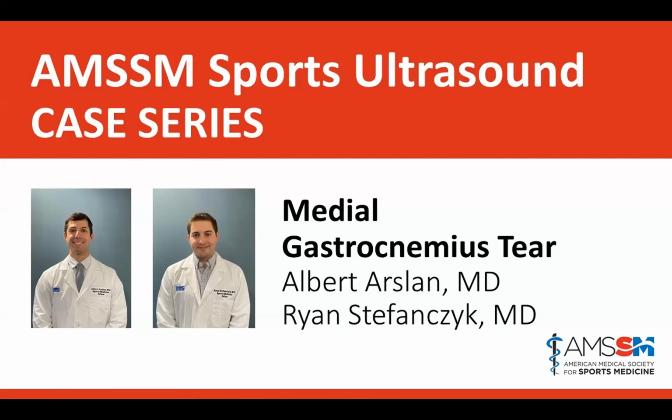And that's a big part of what this series is about: identifying a clinical scenario in which an ultrasound is indicated, and then identifying a methodological way to proceed through a protocol of evaluating for your suspected diagnosis and then ruling out differential diagnoses. Just a couple of comments, and I'll open it up for any other comments or questions.